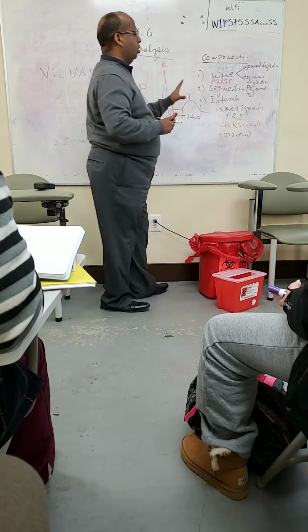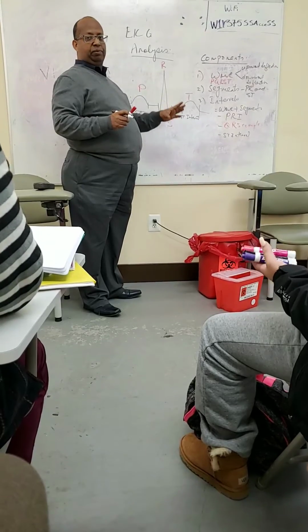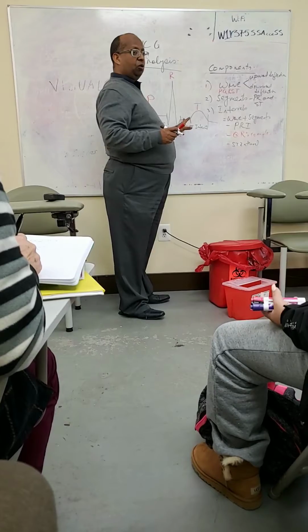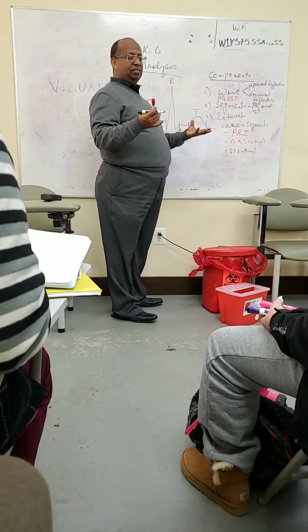So why do we need to know all of this? Because all of them have their own significance. They are very important to tell us something. Let's say there is a problem on the ST segment or on the T wave, they usually tell us something is wrong with the myocardium, the muscle of the heart.